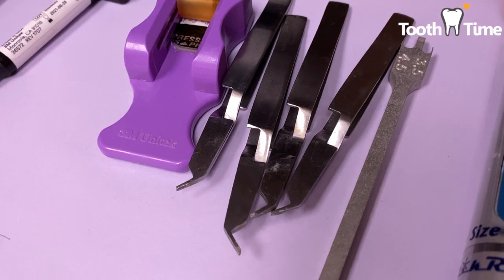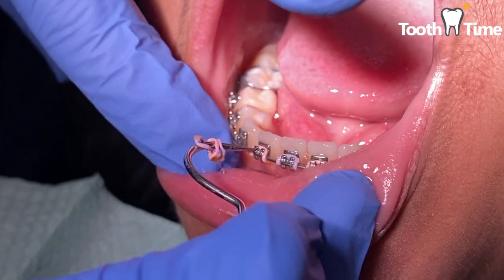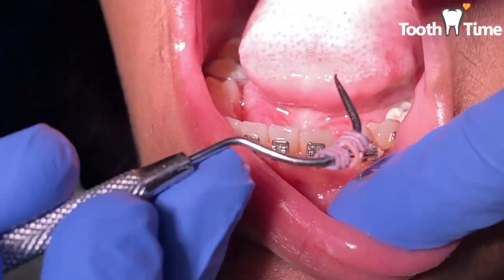Today's visit, we're gonna go ahead and show you how we reposition some brackets, and we're also gonna take off her bite plate appliance. So first things first, we take a look at the panoramic x-ray we took to take a look at which teeth need to be repositioned.